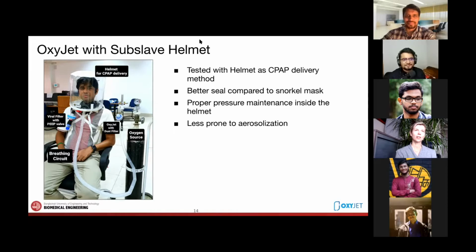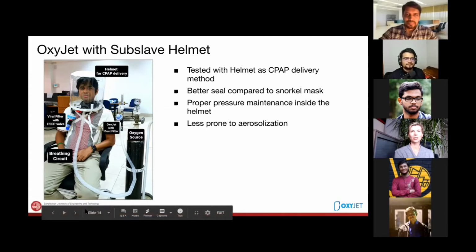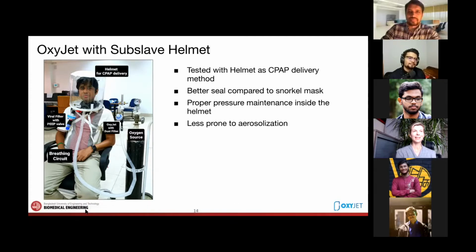Yeah, you covered very important points and benefits of the helmet, and I don't know why it is more expensive than the snorkel mask. When you look at the design, it is much simpler. It is designed so that you can wear it for up to 7 days or even longer for the same patient. Also, some of the helmets can be cleaned and reused again. Again, it depends on the institution that will make that decision.